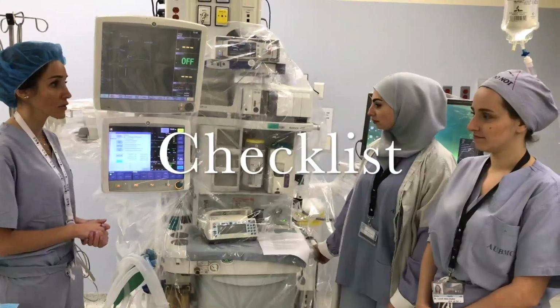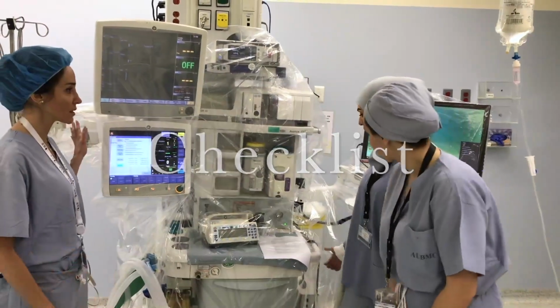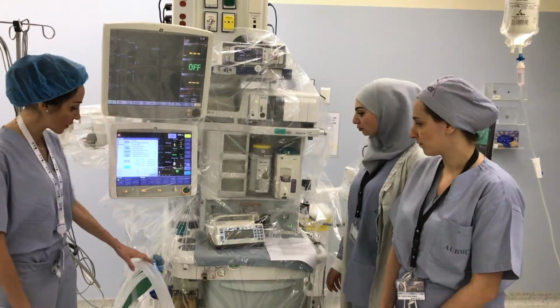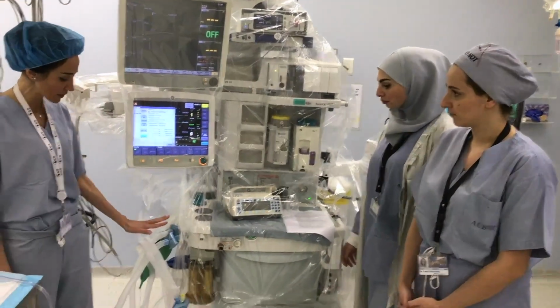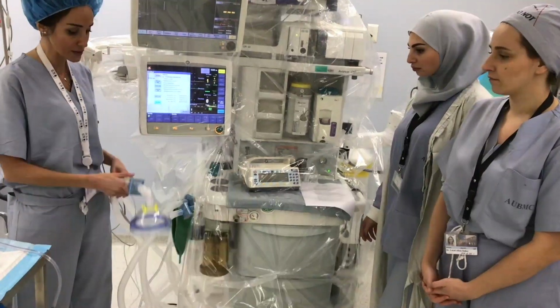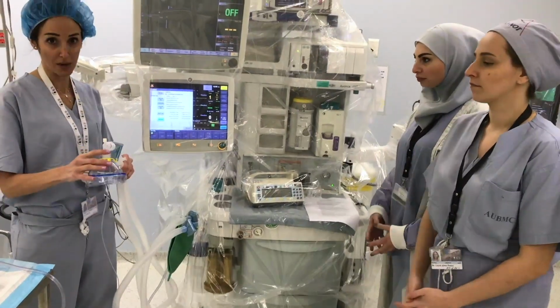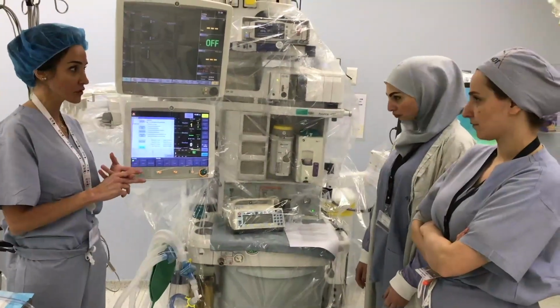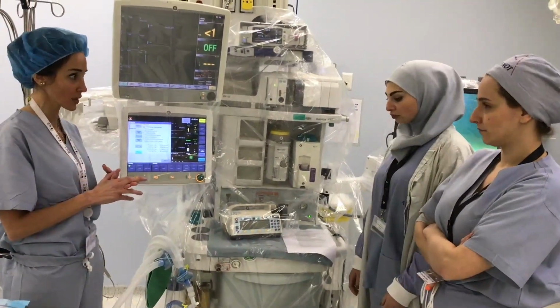So now we're going to go over the checklist. Is the machine checked? Yes. Okay, so we covered it with a plastic drape. We have filters on the inspiratory limb and the expiratory limb, and we have a filter between the circuit and the mask. The Defend has been changed. We have a new capnography line, and we have changed the soda lime between cases.